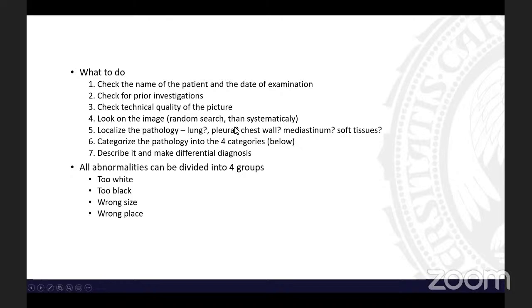Anyway, let's start with the X-ray image. When we have an X-ray image, there are a lot of things we need to do. Usually, students have an idea that I have a picture and I need to tell the diagnosis right away: this X-ray, oh, that's a tumor, that's pneumonia, and so on. That's not how it works. We usually don't tell the diagnosis from X-rays, which is probably a new idea for most of you. We usually say what's there. We just describe the picture. Radiology is a descriptive thing, and we just tell that this is this and this is this, and then we discuss what differential diagnosis this can be.